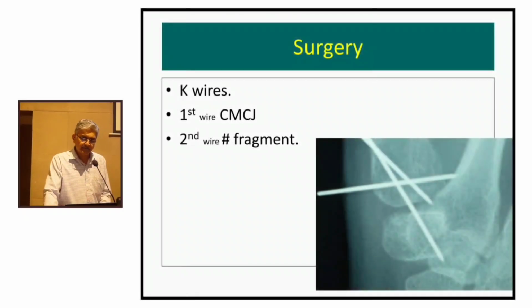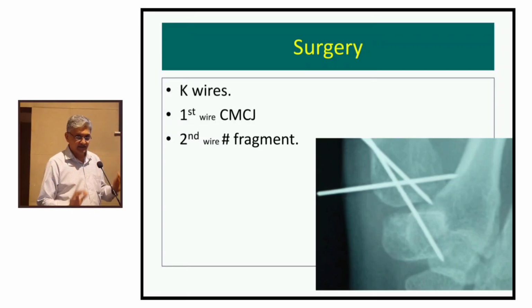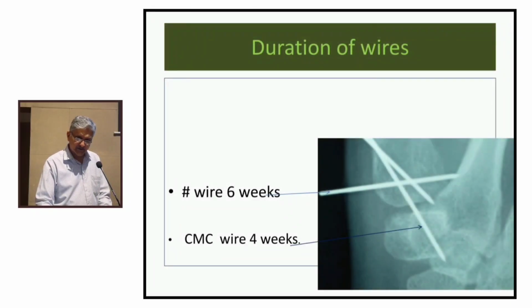Once you have done it, two things: not only immobilizing the fracture fragment, but you have to counter it further, because again you have to neutralize it, and this is done by passing a wire from the metacarpal into the trapezium. So now they remain in place, and the wire in the CMC joint is removed after a month, 4 weeks. The metacarpal wire is removed in 6 weeks time, and then mobilize it.